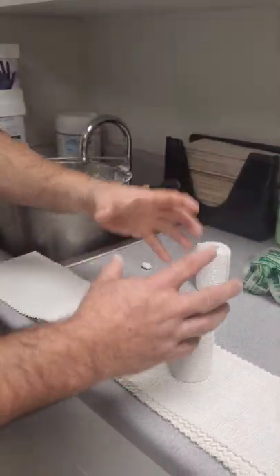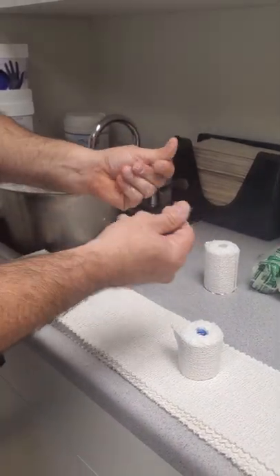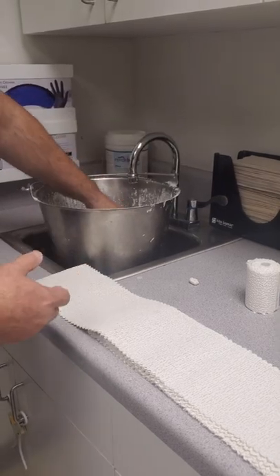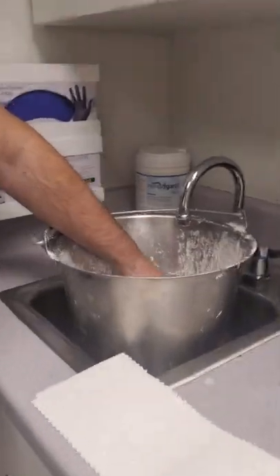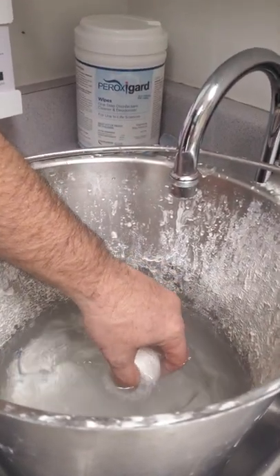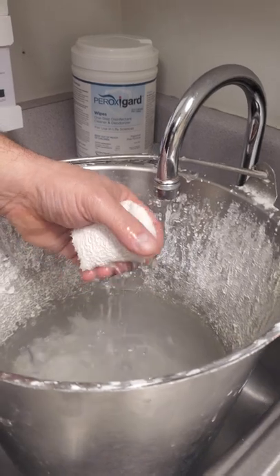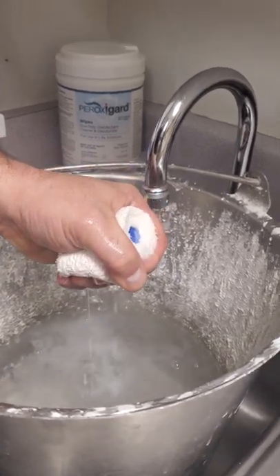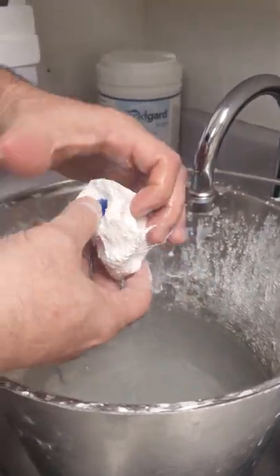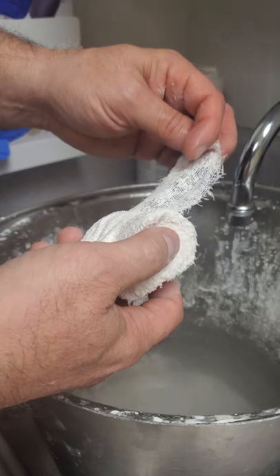However, if you're going to be working with plaster all day long you should wear gloves, because after two or three rounds of plaster in the course of just a few hours, your skin will get remarkably dry. You take your roll of plaster and you submerge it in the warm water, going back and forth to get the water all the way through the entire roll. Then you squeeze out all the excess water because you don't want it to saturate your cotton padding. Shake out the remnants and try your best not to lose your working end.